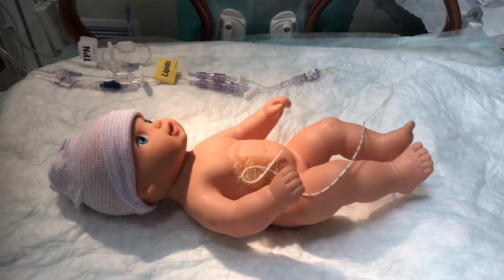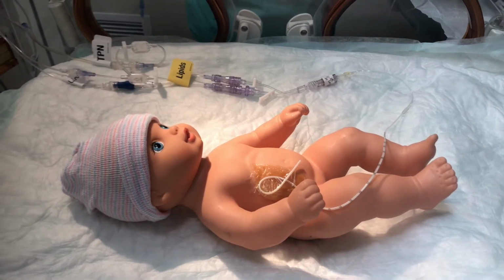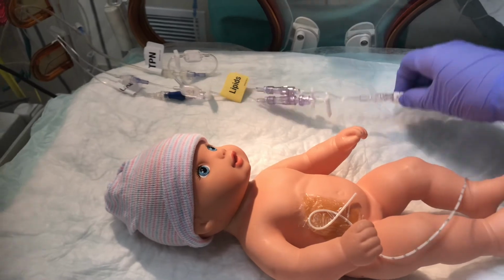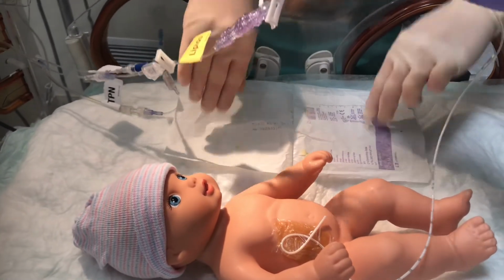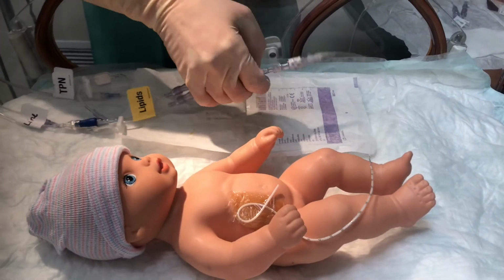Okay, using a second RN, we're going to place that protective barrier that we kept from earlier between the bed and the central line clave. And then we're going to disconnect the tubing.